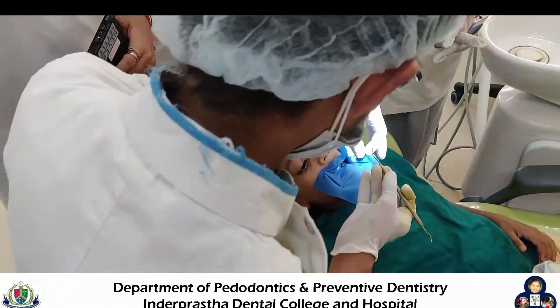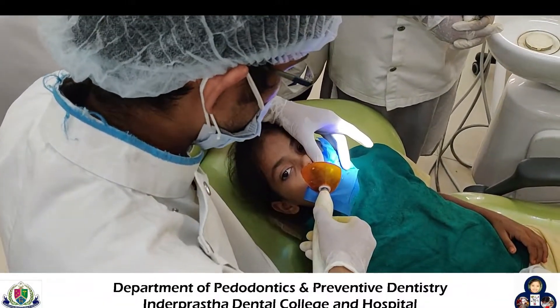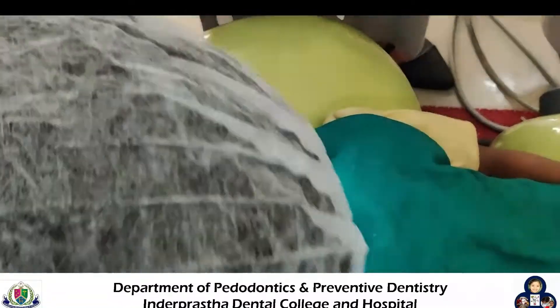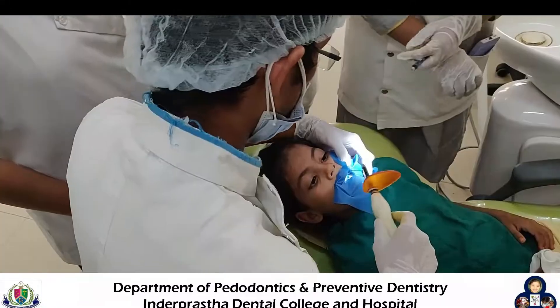After this, we apply composite in the prepared cavity in increments. Each increment is cured for 30 seconds. Another increment is then placed and further cured for 30 seconds.